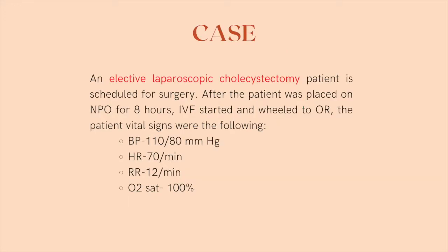The case is an elective laparoscopic cholecystectomy patient that was scheduled for surgery. After the patient was placed in NPO for 8 hours, IVF was started and wheeled into OR. The patient's vital signs were the following: a blood pressure of 110/80 mmHg, a heart rate of 70 beats per minute, a respiratory rate of 12 cycles per minute, and an O2 saturation of 100%.